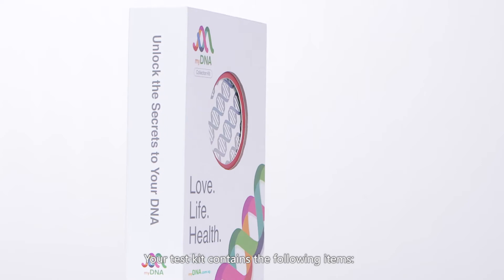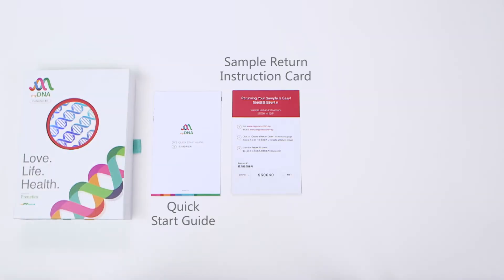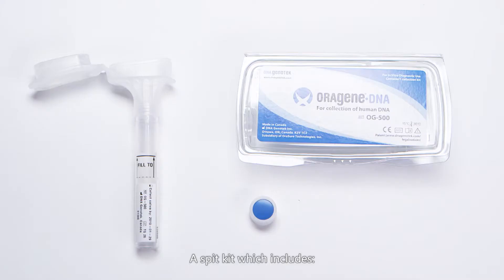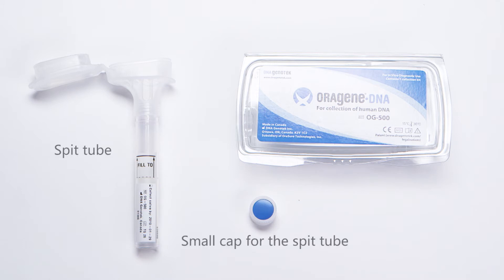Your test kit contains the following items: a quick start guide, a sample return instruction card, a specimen bag, and a return envelope. A spit kit which includes a spit tube and a small cap for the spit tube.